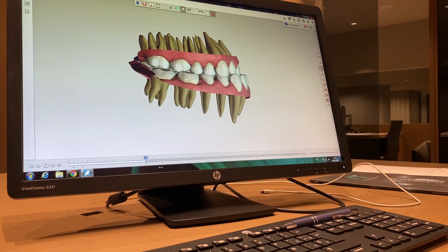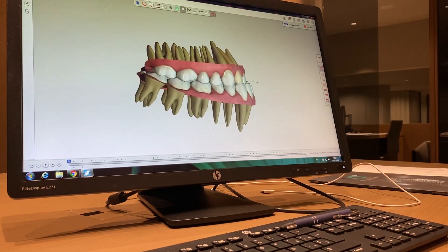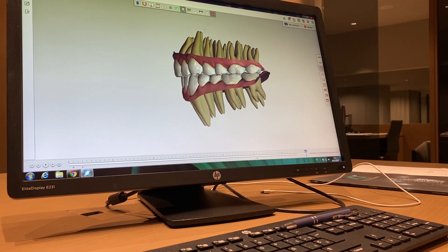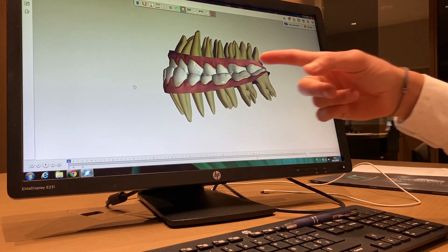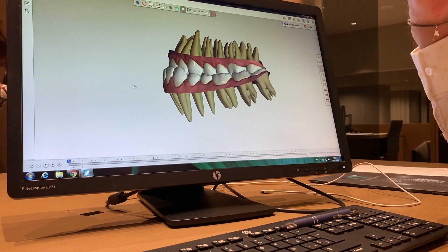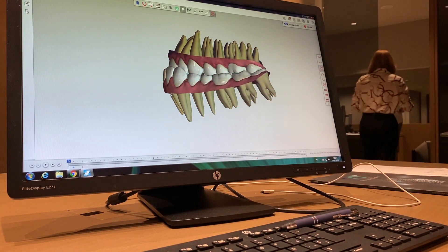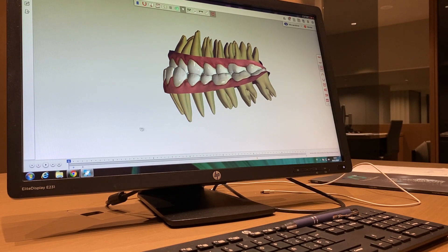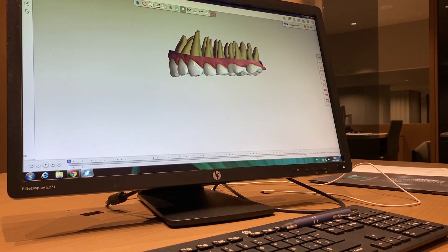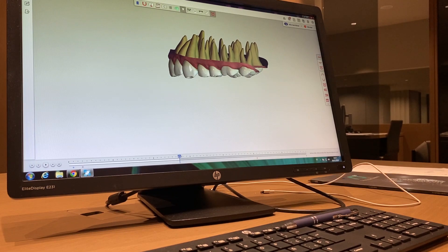There are some mistakes I'm going to point out and modify. On aligner 1 and 2, nothing moves, then distalization starts. The mistake: we have a lower Spee curve that is increased — I need to change the torque to a positive torque and reduce the lower Spee curve. Also, look at the torque in the upper arch — it's still negative or too straight. When you retrotrude, you are going to retroincline the teeth — that's a mistake.